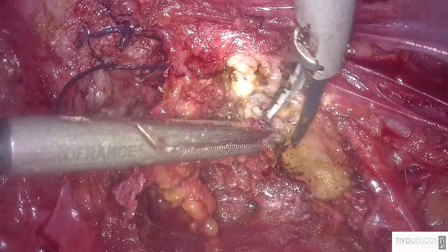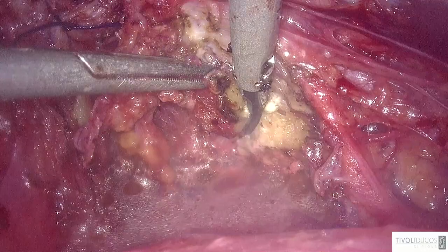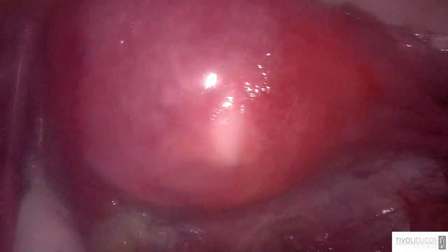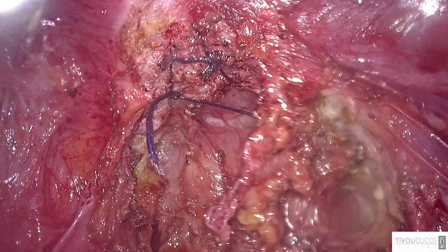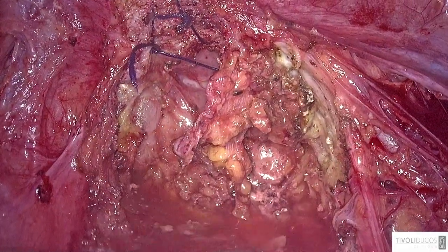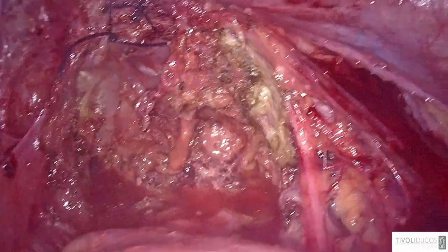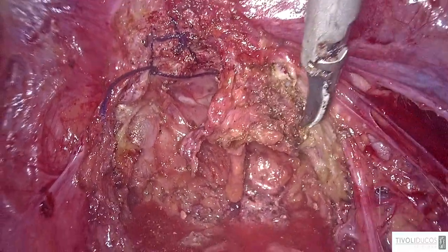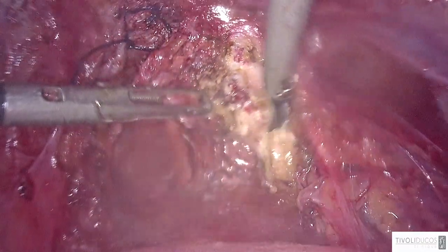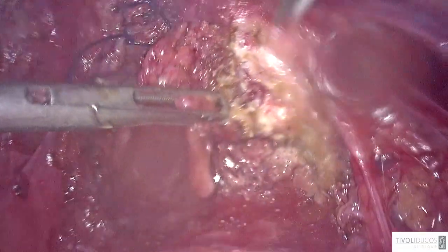So I used it once, and it is very nice. I removed a big nodule of the parametrium, and the patient could void the bladder very well, and I think it is very interesting to do. I think we have to improve our means to identify the nerves, at least the nerves going to the bladder and to the vagina. Because if we injure them, you may have severe bladder dysfunction requiring self-catheterization, or you may have vaginal dryness, which is very, very embarrassing for sexual intercourse. Okay, clean, please.